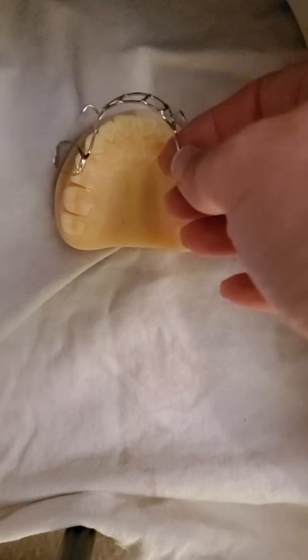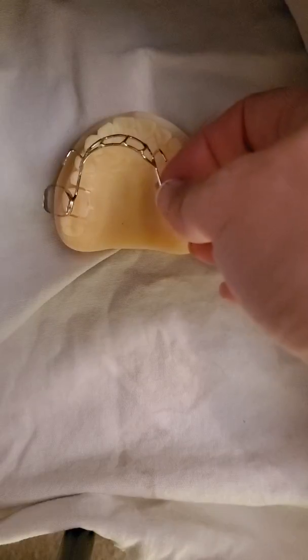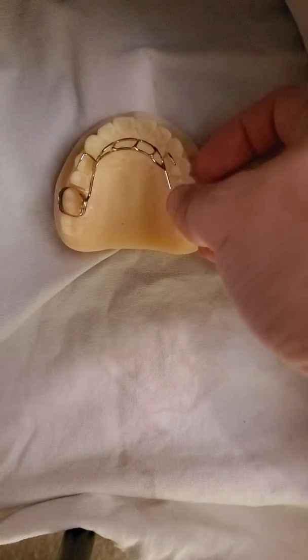Okay. So you're just using a little band cement. My favorite is Band Lock from 3M Unitek. Reliance has some great band cements too. Just keep in mind, some are self-cure, some are light cure. I like the light cure ones better.